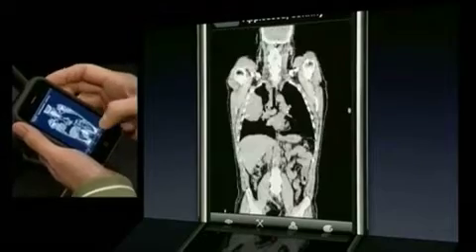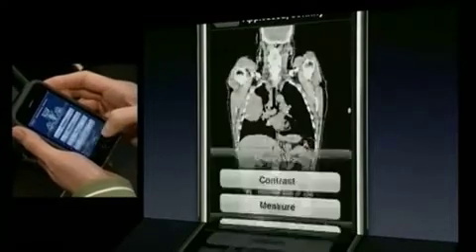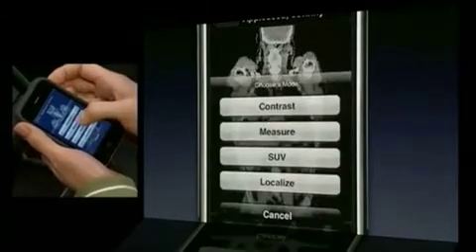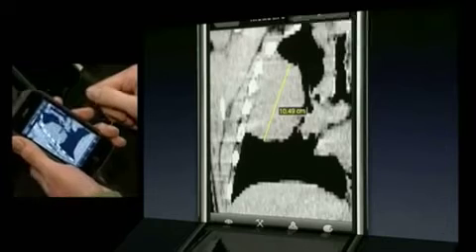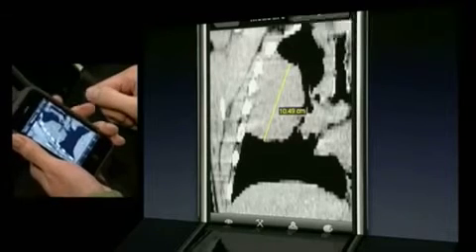Let's look at the measurement tool. Touch and drag to position the start of a measurement line, and do the same to complete the line. That line will remain on that slice until removed, which you can do with a shake.